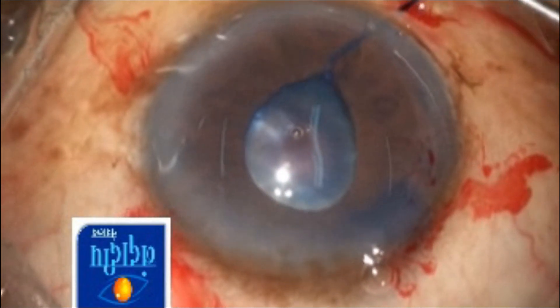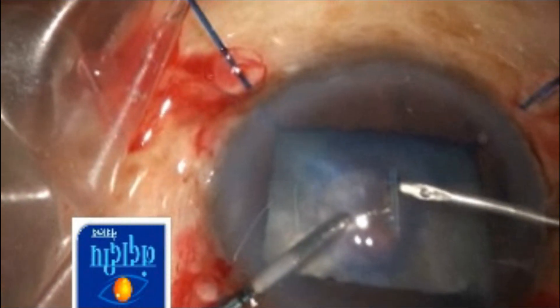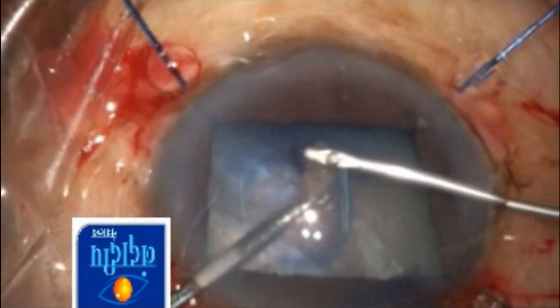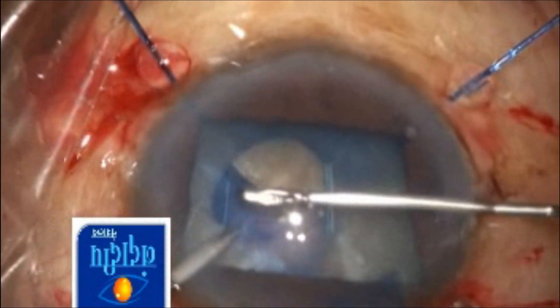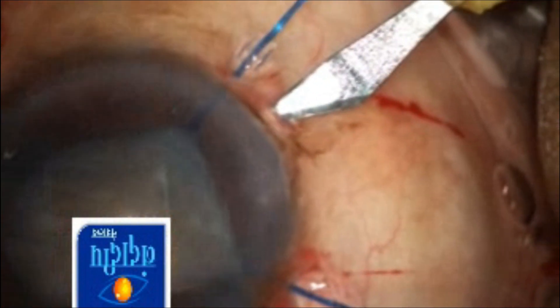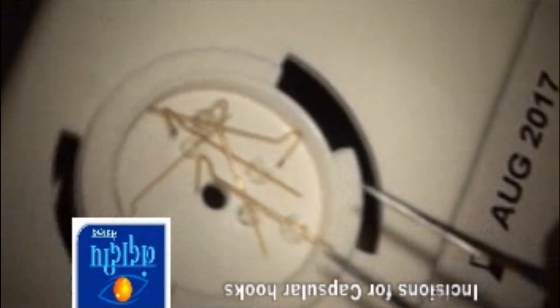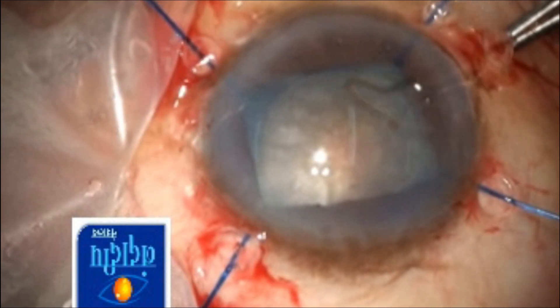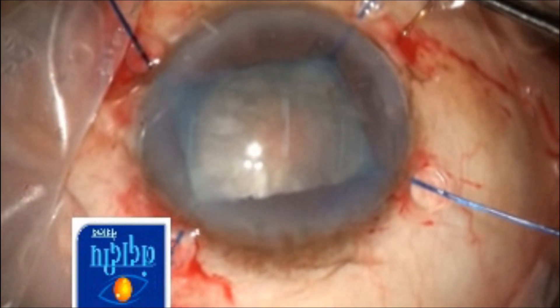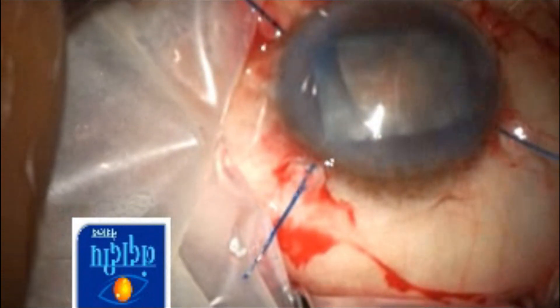Now, what to do if you have a non-dilating pupil with weak zonules? Iris retractors are the best device to use in such cases because you can assess the zonular area really well and enlarge the pupil size to the desired size. Some surgeons use capsular hooks to dilate the pupil and then insert the same capsular hooks into the bag once CCC is done. Here I am inserting the iris hooks first and then inserting the capsular hooks later. Both ways you can manage a case of small pupil with zonular weakness.